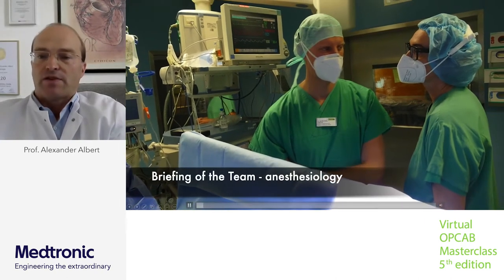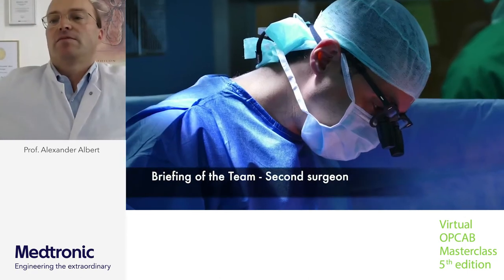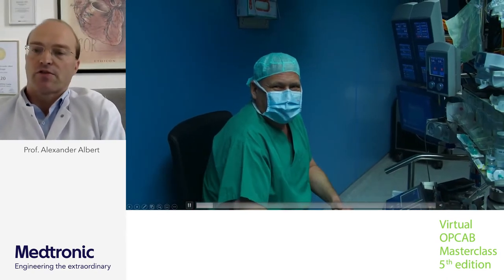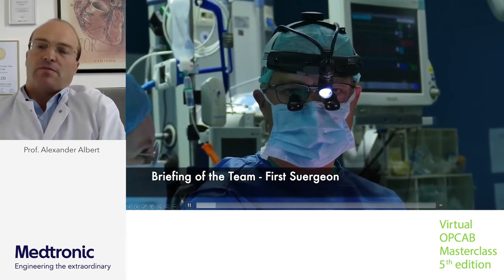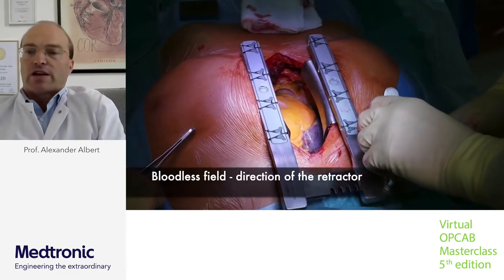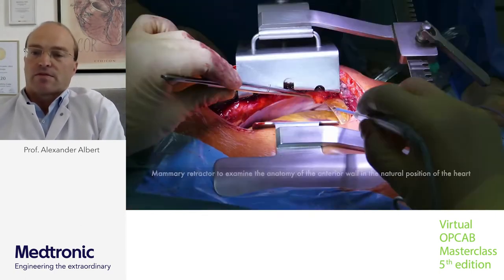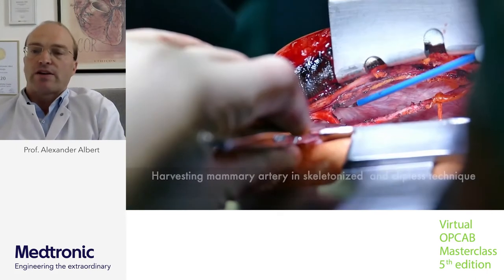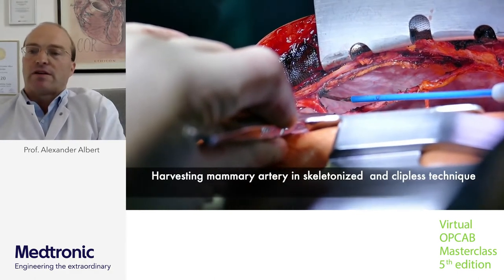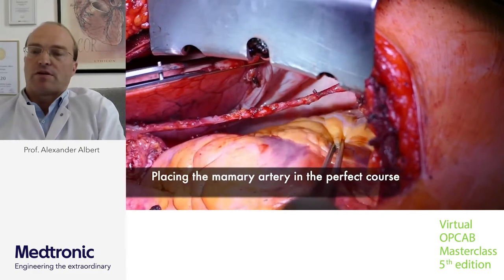Before starting the procedure, we brief the team — discussing the patient and the special features of this case. The perfusionist, who is not always in the room, is a member of the team and presents himself before starting. We check the hemodynamics. A bloodless field is very important. At the beginning we see only the right ventricle; we then harvest the mammary artery using a clipless technique and open the pericardium.